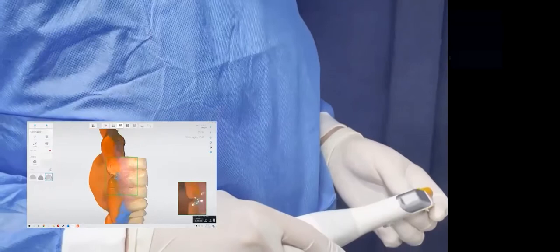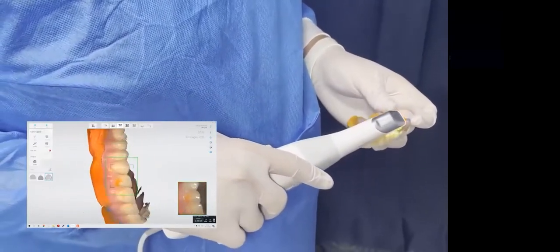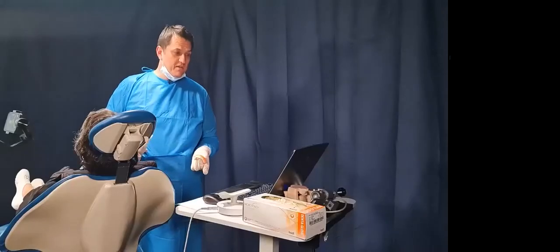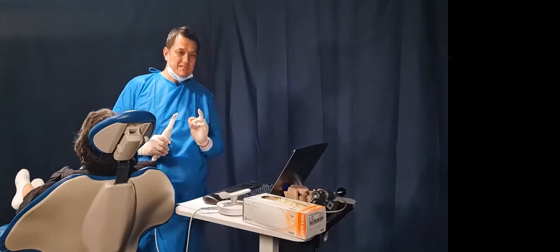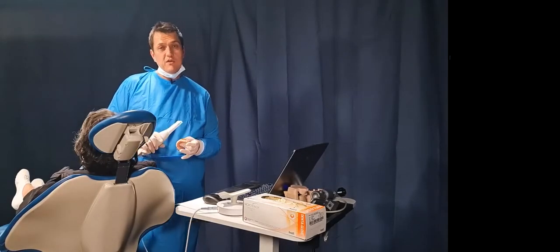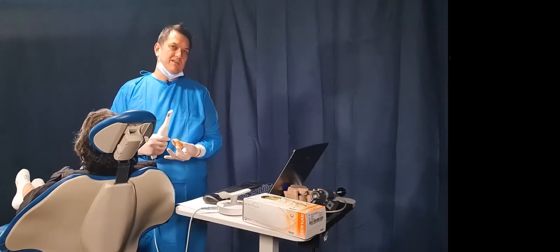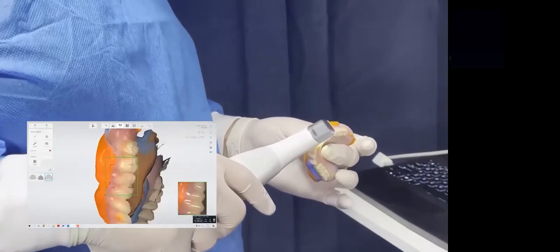Joining the sulcus, the fitting surface, all into the one scan, and doing it accurately without overstitching, which is, again, quite tricky. Now, okay, so I've now stuck it all together. I've pretty much got most of the tooth records. Some labs may want, if you want to, for example, reference the current teeth, you may want to roll to the occlusal as well. It makes it a bit easier, a bit more visible for them to see if they want to remove teeth and put teeth back into those same places. So if you wanted to do that, it's just simple, just rolling over. It's not a big deal.